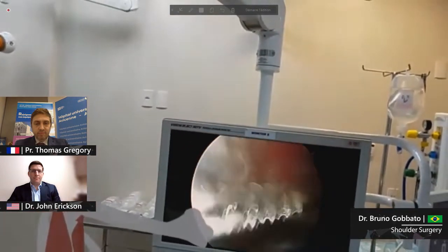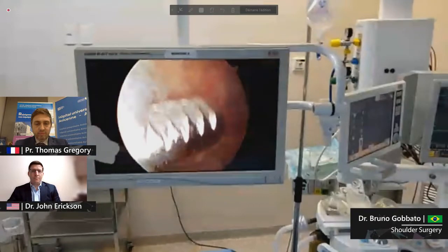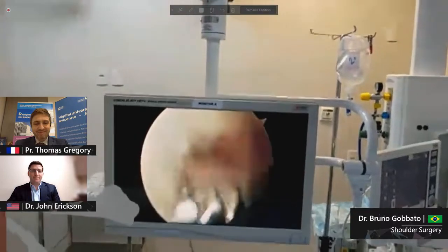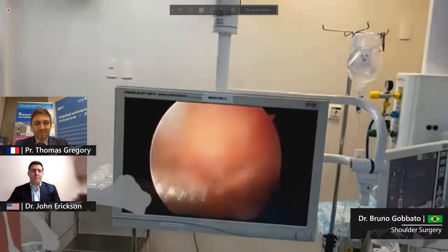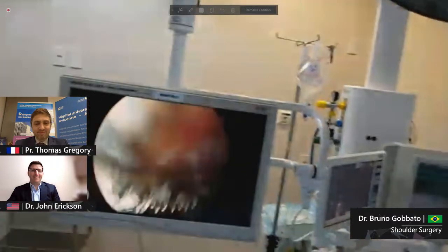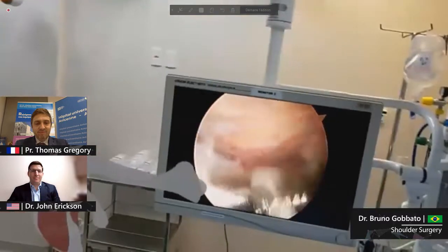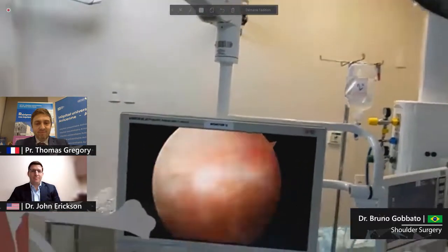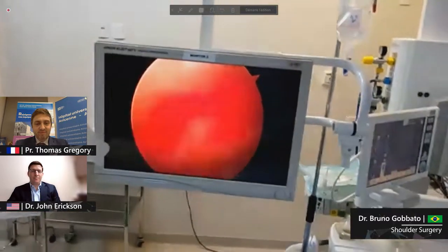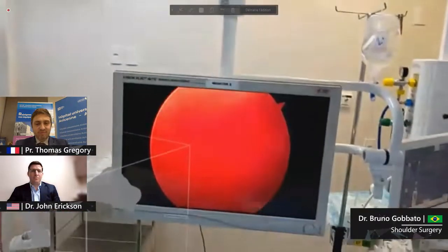Again, we have learned a lot with you, Thomas, how to use this kind of technology, even for hand surgery. I think I followed some hand surgeries on your early start. Yes, some scaphoid surgery I think you have done. I really think mixed reality can be very useful in different kinds of surgeries, but we have to start at some point.